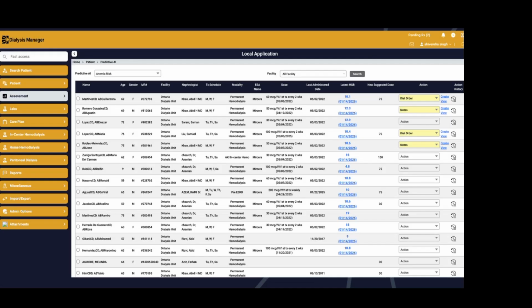Oh, thank you, Ryan. So I'm excited to talk about this feature because I think that this is such an important and costly part of providing dialysis care. And obviously, the medications for anemia management are high-cost medications, and we want to be efficient in that regard.